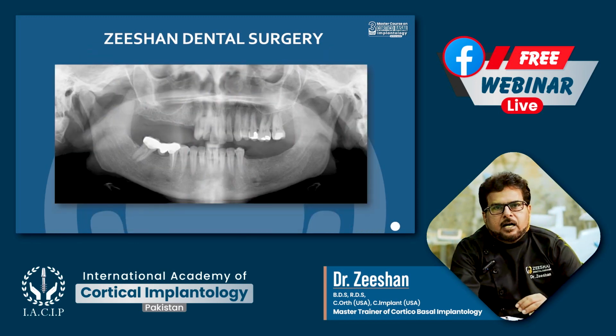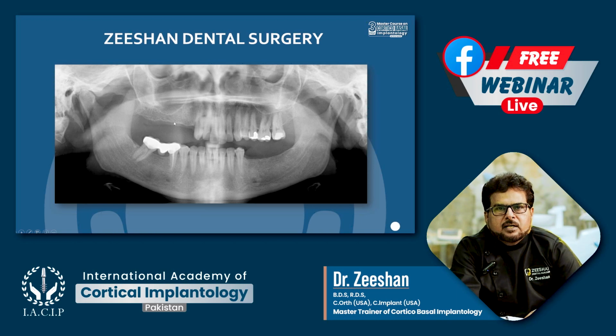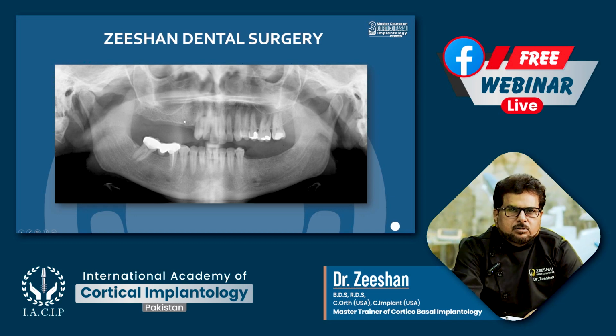See, now we are discussing the segments. You can place implants for such cases and load them immediately, but again we are asking you to learn the skills of immediate loading. Here we can place a few implants to engage this area at this angle, 2 or 3 anterior to the sinus, and bypass and place one or two implants posteriorly in the pterygoid region, and then you can restore them with the bridging technique.